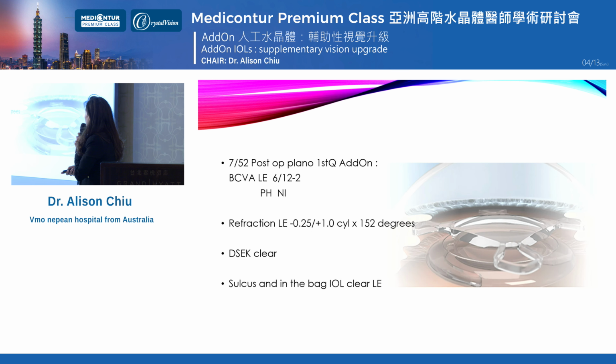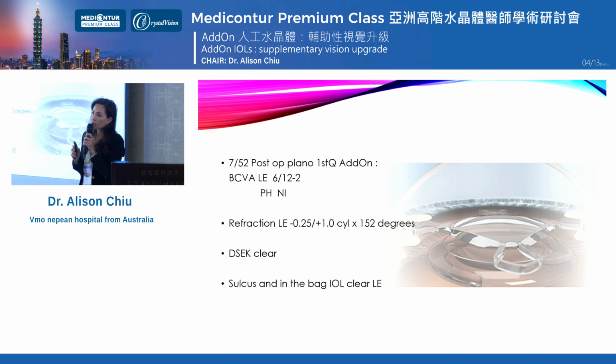So to date, this patient has done well post-DSEK, and we've been lucky in this case because the AddOn has not had any issues with opacification, but if it does down the track because of that transient air bubble, then we can take it out and that Zeiss lens in the bag is going to be fine.